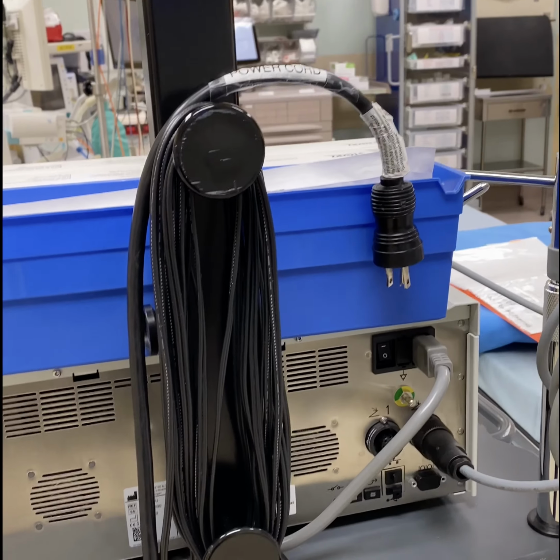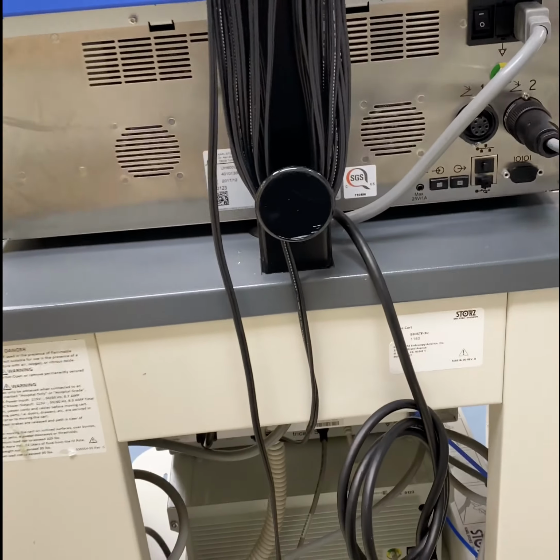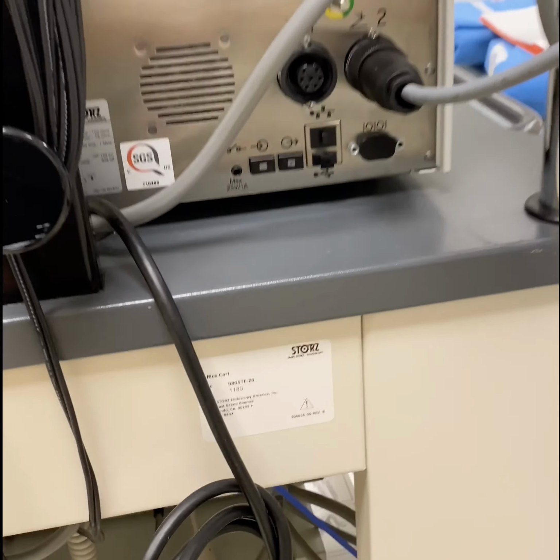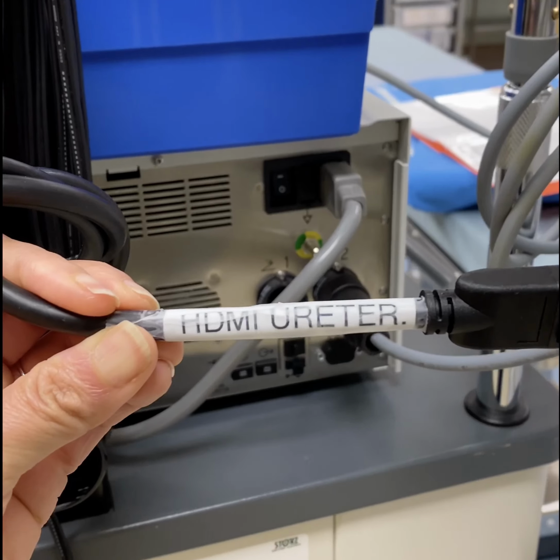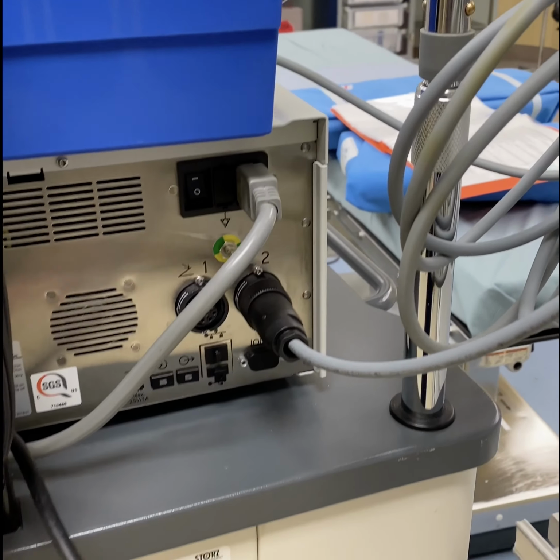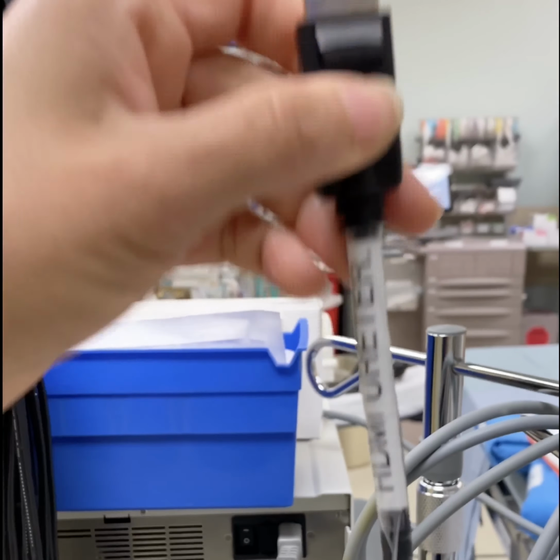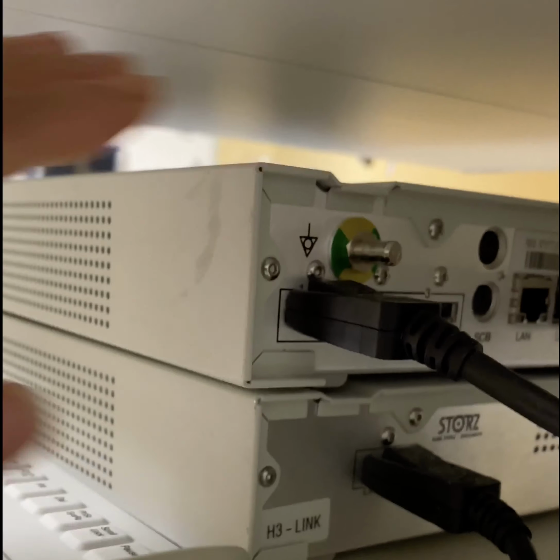Once you turn off your camera box, you want to hook up the HDMI cable. That's the cable that connects the digital ureteroscope box to the regular camera box on your boom. I went ahead and labeled it. It says HDMI ureter. This is the cable that's going to connect to the back of the image 1 box. Let me go ahead and just untangle this. All right, now that it's untangled, you're going to plug the HDMI ureter cable into the back of your image 1 box. Your image 1 box is this one up top here.